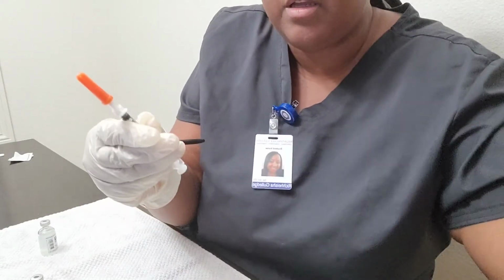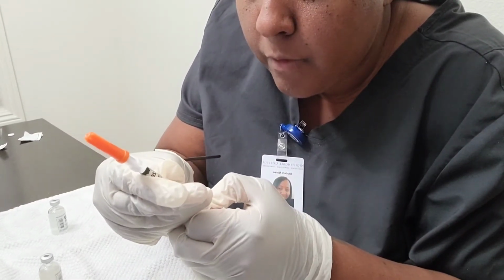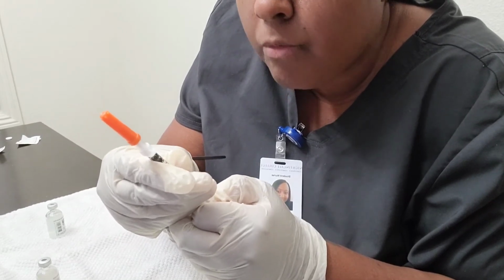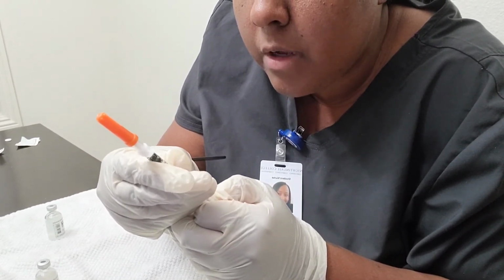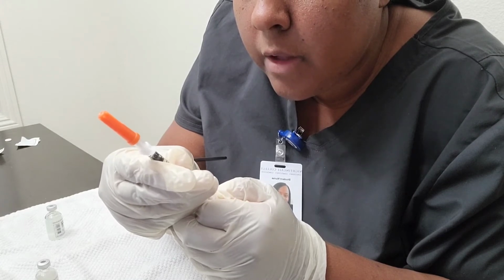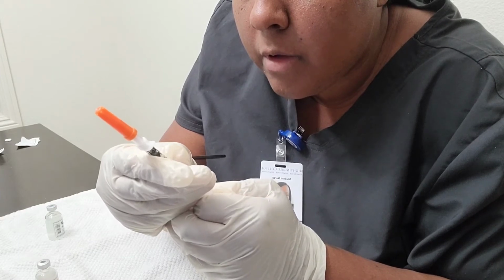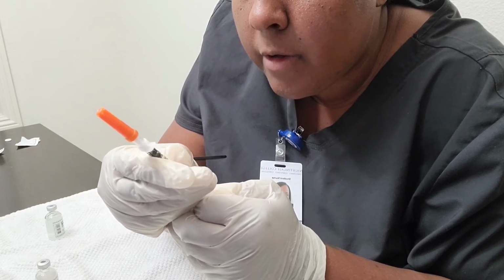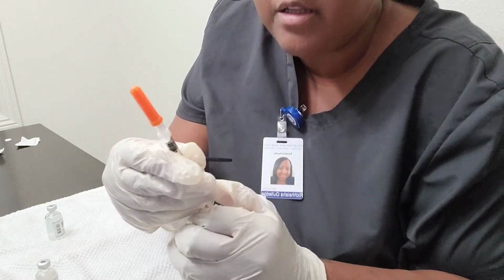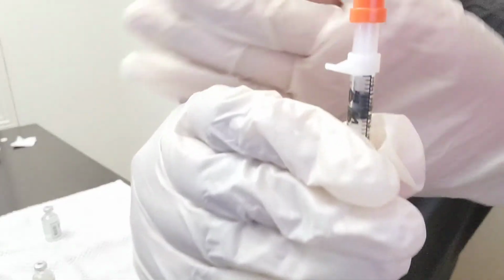So let's take that. Okay, hopefully you can see that.